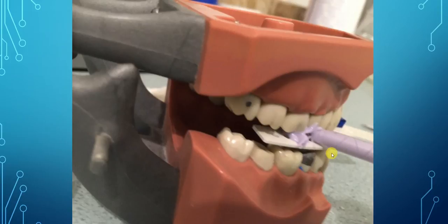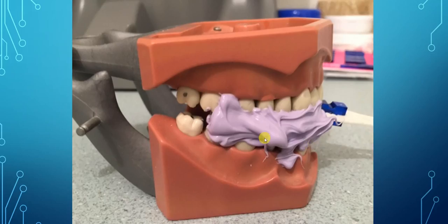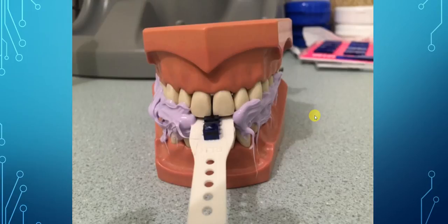Inject the Regisil on both the upper part of the tray, squeezing underneath the teeth and then under the lower part of the tray, making sure to get extra coverage over the facial buccal surfaces. It doesn't have to look pretty, it just has to fill that in real nice. You want to go on both sides the same identical way, squeezing in nice and hard on both sides. You don't need to go into the front for this particular because we're scanning.